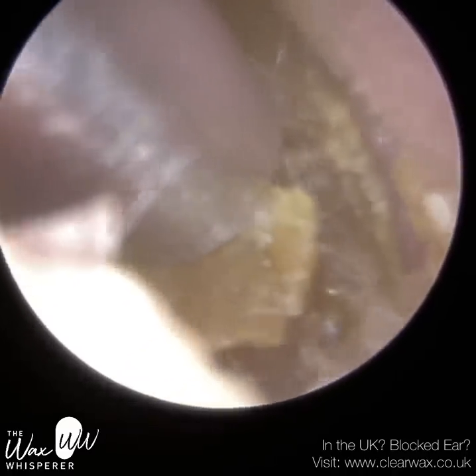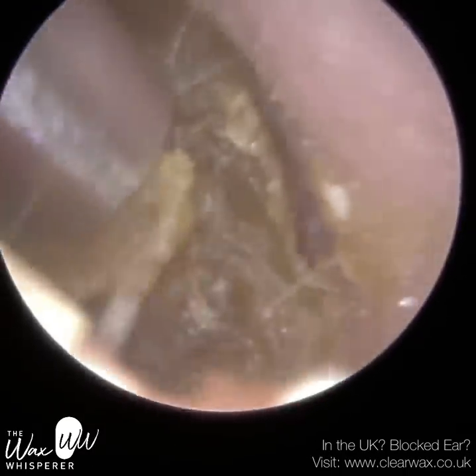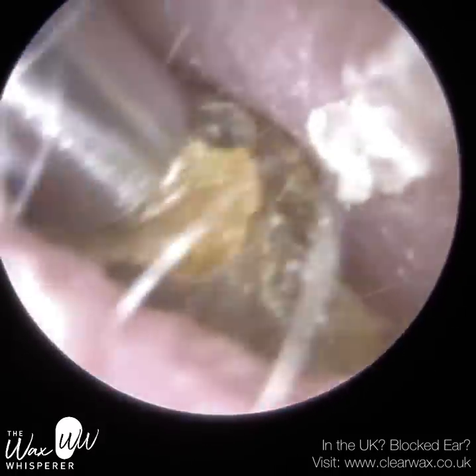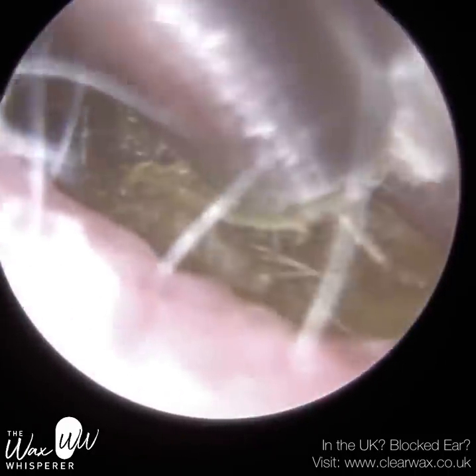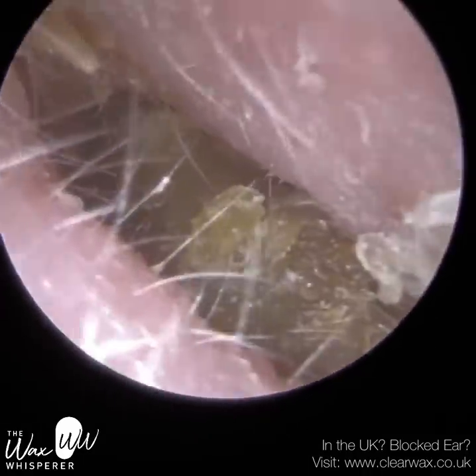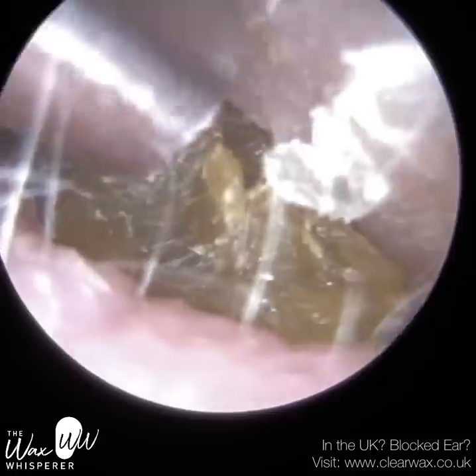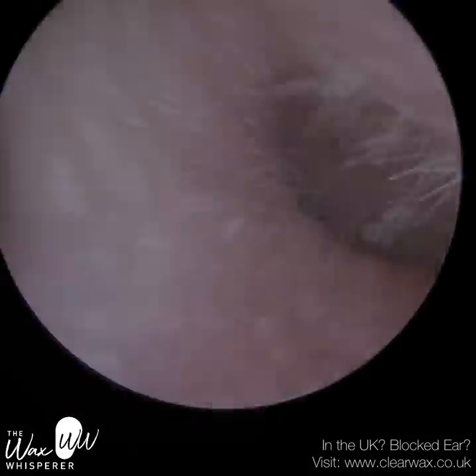The way we're tackling this is that I'm holding the iClearScope, which is our endoscope. An endoscope is almost like a telescope — a magnifying lens with rod lenses. There are special lenses fitted inside the endoscope which give it its view. You normally peer through the eyepiece with one eye, so if I'm using an endoscope without the camera attachment, I would close my right eye and look through my left eye — squinting through a small eyepiece, so the image is small.